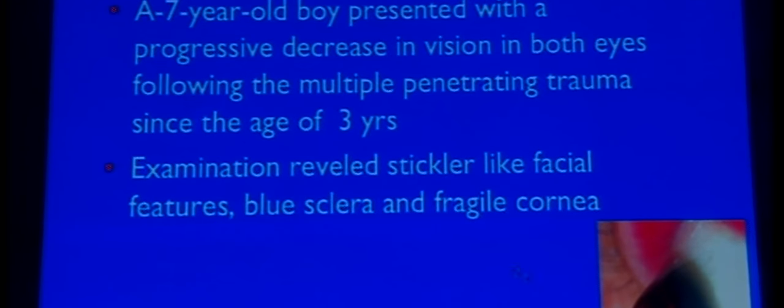Another case involved lime retained in trauma — not only affecting vision and cosmesis but present for about six years. An eccentric graft was required, and femtosecond laser was used for careful dissection. Postoperatively, despite the lime being present for a significant amount of time, the endothelium was absolutely fine on specular microscopy. On OCT, the lime soap was occupying almost 50% of the corneal stroma. Following DALK, despite a much thicker cornea, the outcome was very good.